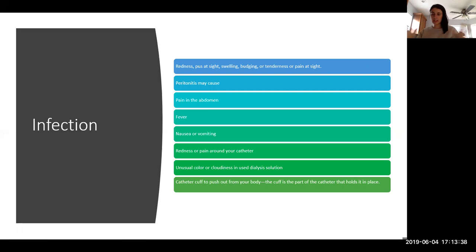The rest can be done not under sterile procedure, but like emptying the fluid when you're done. You can just actually throw that down the drain. But infection is huge, especially for these people that are suffering and have PD.